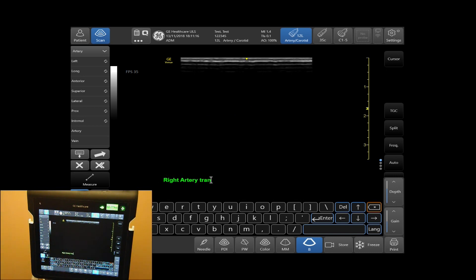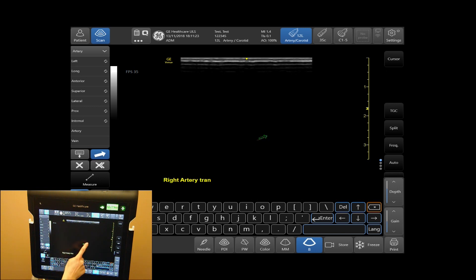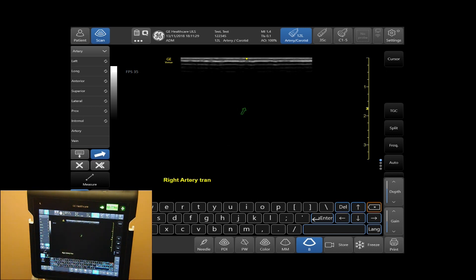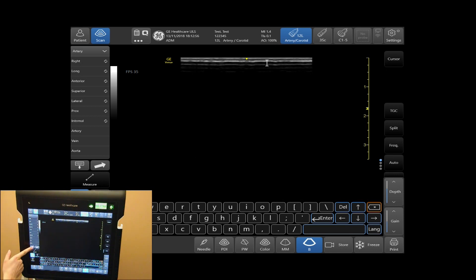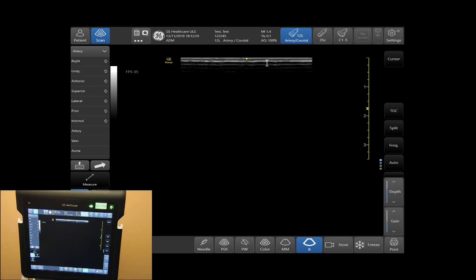You can also add an arrow by selecting your arrow tab. Here you can tap and drag alongside your screen. You can delete your arrow or your last comment by selecting your single X. If you want to clear off your whole screen, select your double X icon. Simply tap your keyboard icon and it will disappear. You can do the same for it to appear by tapping your keyboard icon.